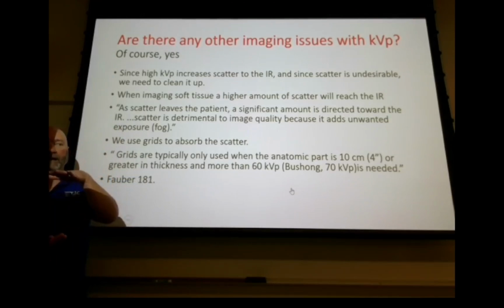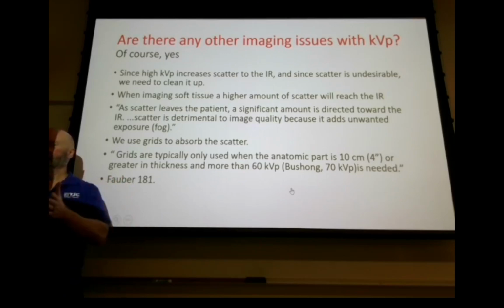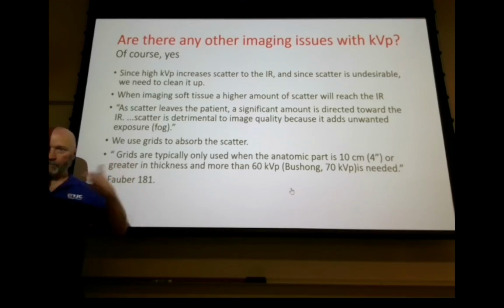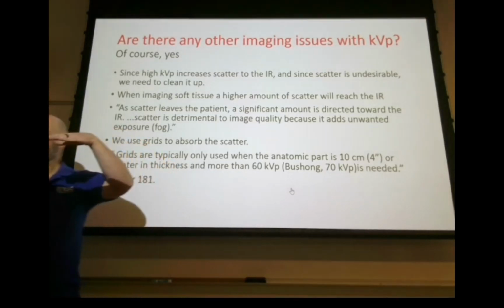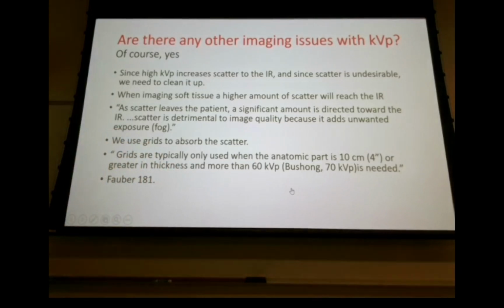So we got thickness of the tissue. What's the other area that we might expose? The length of it? Collimation, beam restriction. If you expose more tissue, either this way or this way, you create more Compton. Okay, you're going to create more scatter radiation.